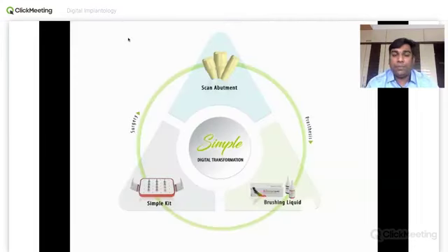Whenever you see a patient with simple digital transformation, what we need is a simple kit, a guided surgical kit. We do the surgery. Then we move on to the scan abutment during the prosthesis. We scan instead of taking the impression. And then we give it to the lab for the milling. And then again, giving a crown to the patient. So simple three steps. We'll be discussing everything in these three steps about the digitalization.